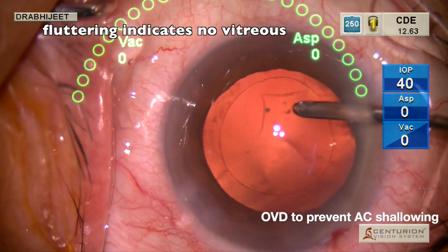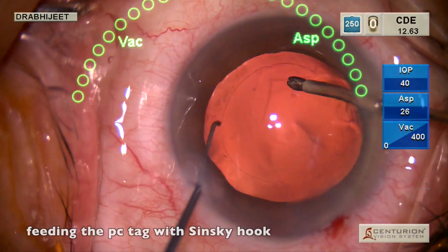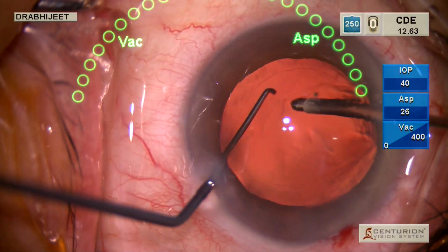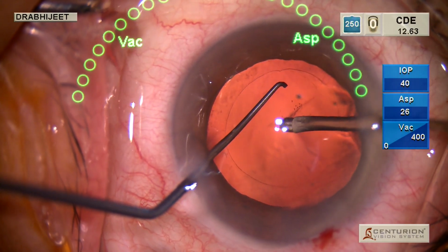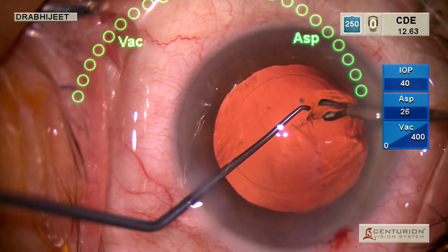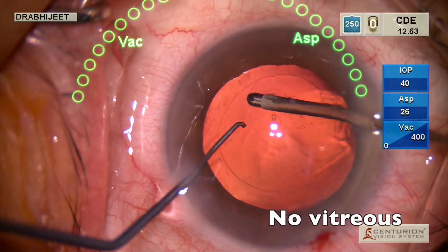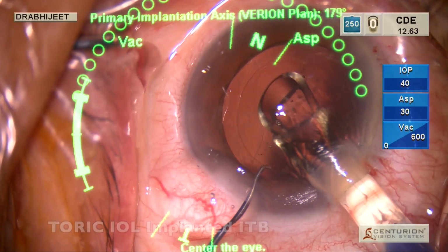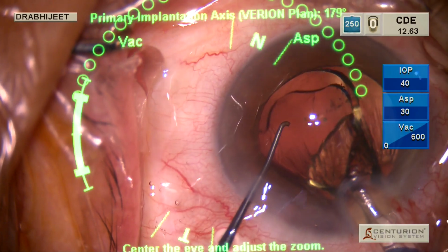At this stage, we put in an OVD to prevent the AC from shallowing and the tear from enlarging. Now here we are using a technique in which we are feeding the flap to the forceps, the micro-axis forceps, and we create a PCCC without any vitreous loss. All this while the tag is having a fluttering sign, and that signifies that there is no vitreous which is coming to the AC through the PC rent.